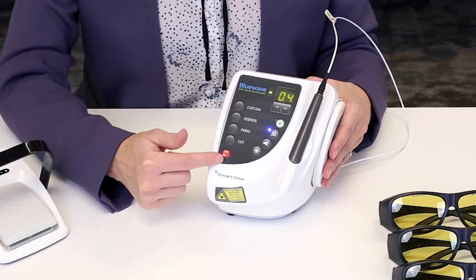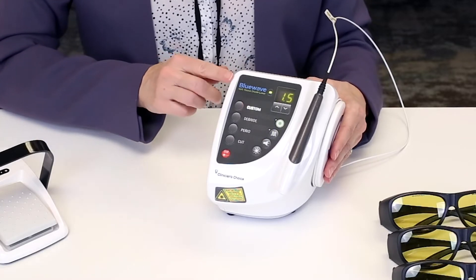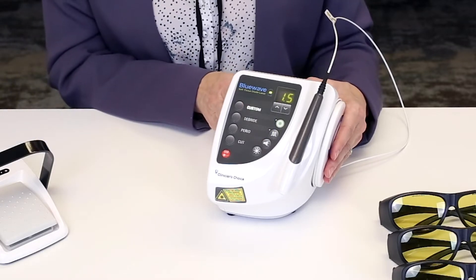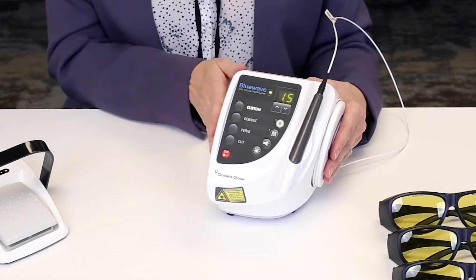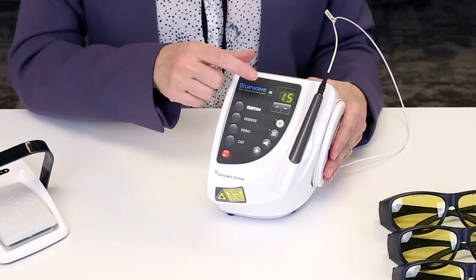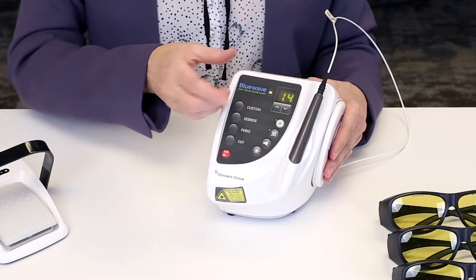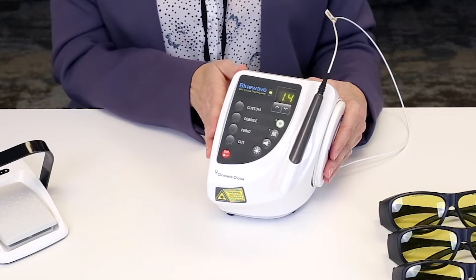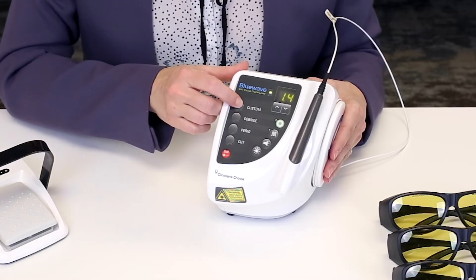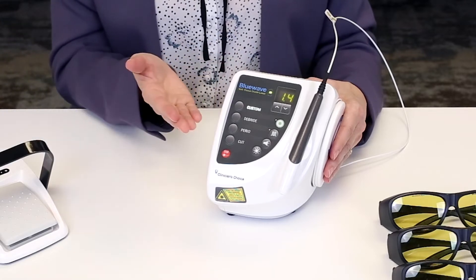Here are the preset buttons. Your first preset is known as custom. When you press the custom button it comes preset from the factory to 1.5 watts. You can easily adjust this up or down using your keypad. If you'd like to save a new preset simply hold the custom button for 3 seconds. Now you have a new preset.